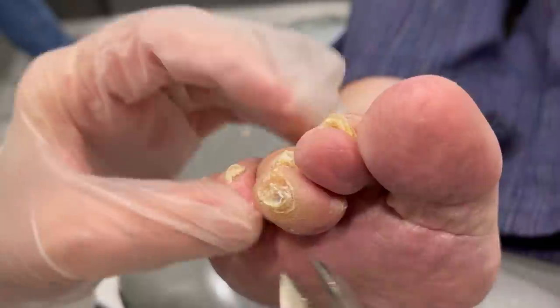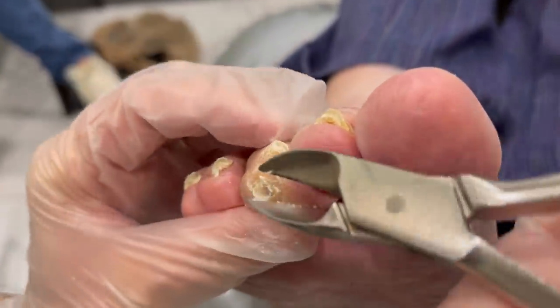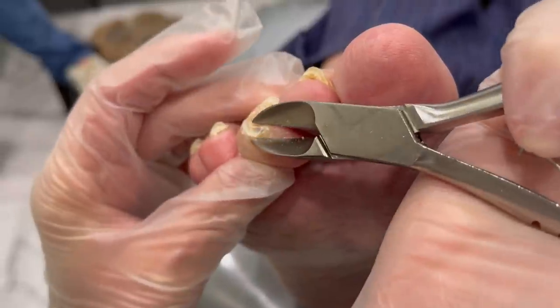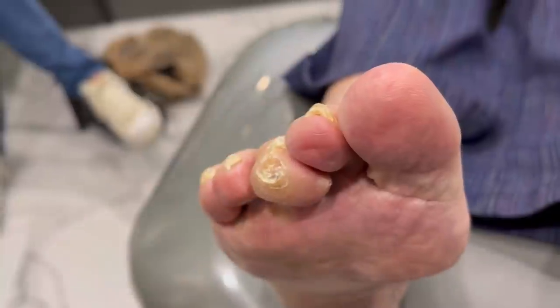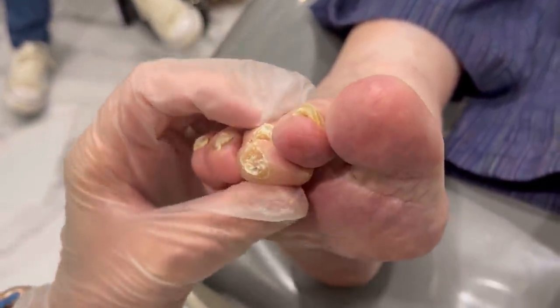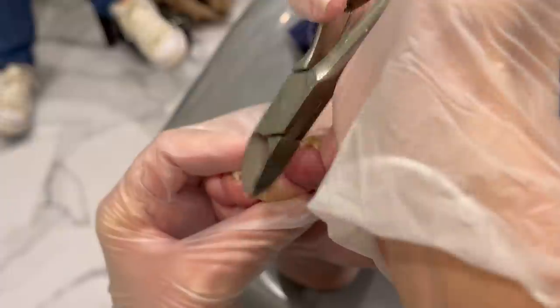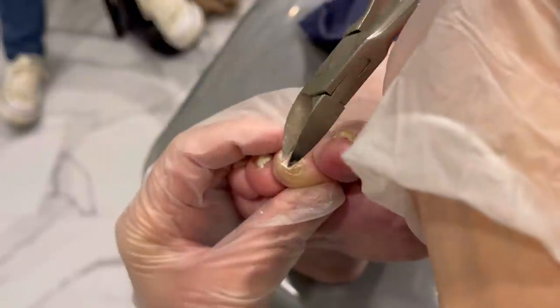I'm not in the business of torture here, but I'm just afraid to grab too much because she pulls away — it's gonna just rip it off and it'll be way worse than what it is now. So let me see if I can get a little... that's real hard. I'm looking for just like a little edge to lift up the rest of it. There we go. I know, you're doing great.